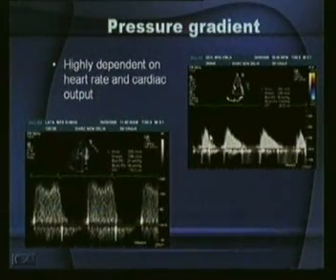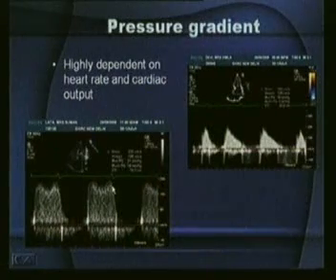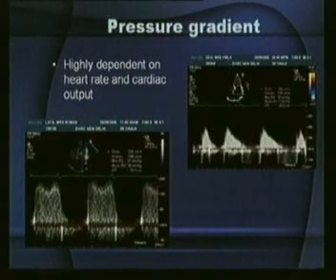And in contrast to this is mild mitral stenosis, because if you look at this, this is the E point and the pressure gradient equalizes in no time at all. Here it is not equalizing even at the end of the A wave, and you find such a large gradient across the mitral valve. Remember, this gradient is at the mitral valve level. So if you are doing a catheterization, you will have to retrogradely put one catheter into the LA and then put one catheter into the LV, and only then you will get it.